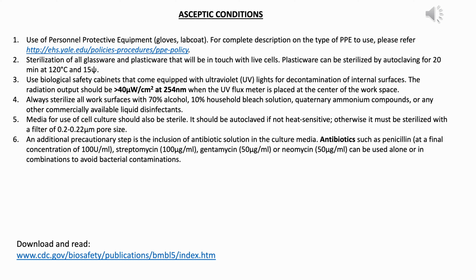One has to spend time with your cells every day, looking at at least 5-6 different areas within your plate. You are basically talking to your cells every day. That way one can avoid possible contaminations within your cell cultures, and if there are any, one can address them early on if they are detected.